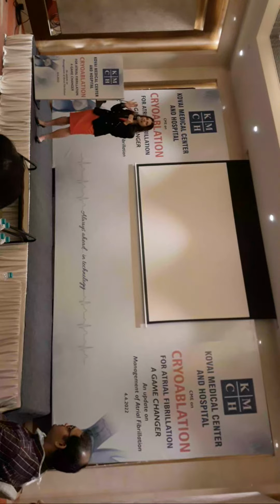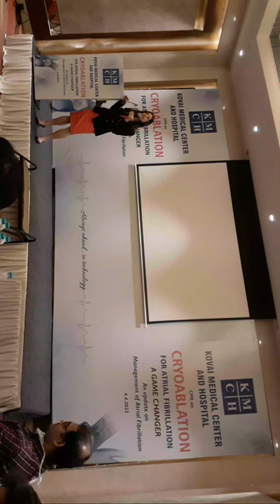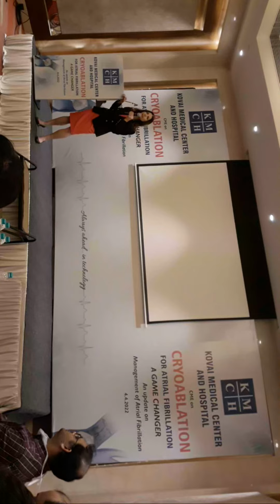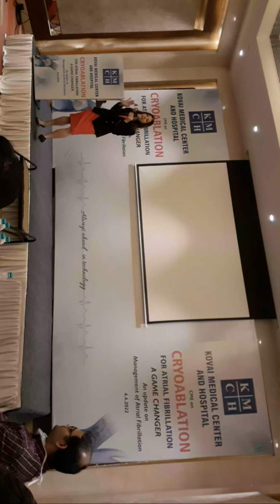That being said, I find tall, slender females still to be the highest risk group for temporary phrenic paralysis, just the way that nerve runs, especially right outside the right superior vein. So we're ultra cautious. But in my experience, I've had a few over 11 years, and they've all recovered.